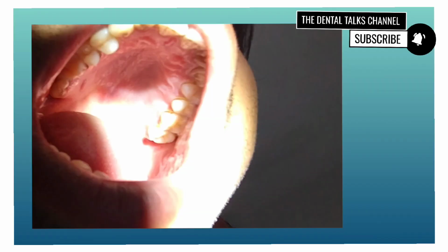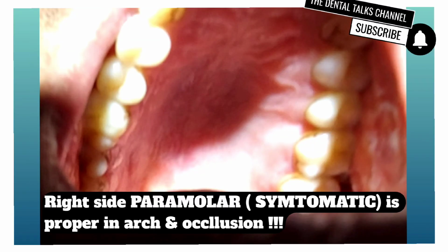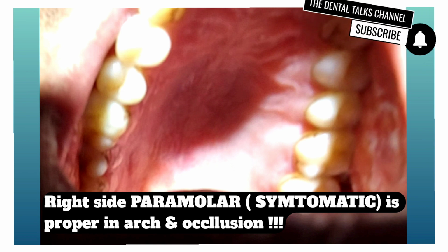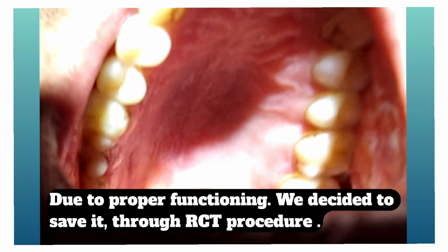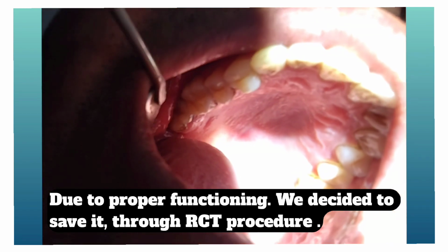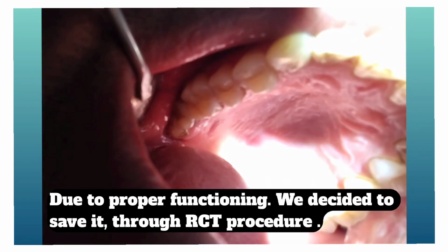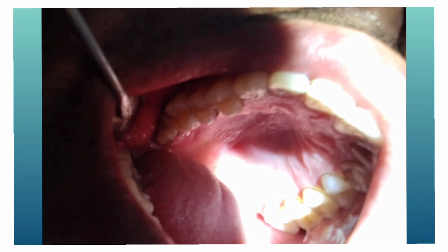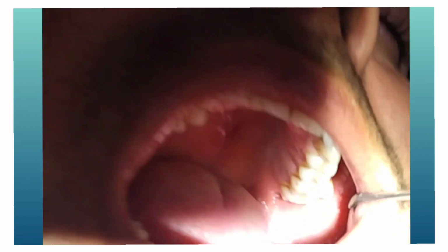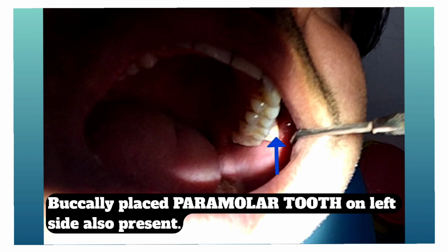So now back to our case. Here we found a paramolar on the right hand side, in between the first and the second molar in the arch. We decided to save it as it is forming a proper occlusion with the other teeth in the arch. But on further examination, we also found a paramolar tooth on the left hand side, which is buccally placed. After the clinical examination, we did the X-ray of the symptomatic tooth.